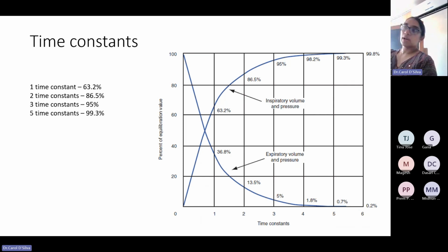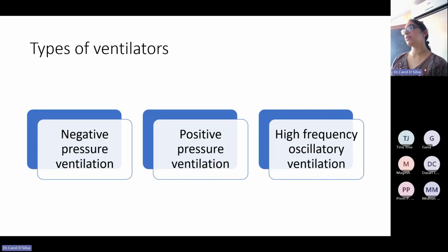Okay, so it's okay if you don't understand time constant. I didn't even intend to tell you about this, but because you all are still awake, I'm telling you. But this is a concept that you guys need to understand. I hope you all understood this concept. Anyway, I cannot cover it fully because this is a separate class by itself. I'm just trying to explain what happens when you're inflating or deflating, and how important R and C, resistance and compliance, are. Because if the resistance is more, more time is required to deflate. Even if you don't understand this, leave it, don't bother. But until here, you all understood the pressure gradients, the concepts of compliance and resistance; something has got into your head.